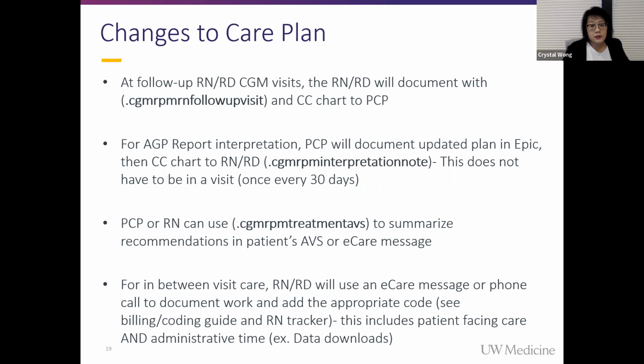For report interpretation, there's that interpretation note, as I just mentioned. You'll put this in Epic and CC it to the RN/RD. You're only allowed to bill this once every 30 days, so you kind of have to track it a little bit. One of the enhancements that we'd really like would be a module that actually tracks time and drops codes automatically. We do have some similar modules for care management. It's just an enhancement that IT is not able to support yet.